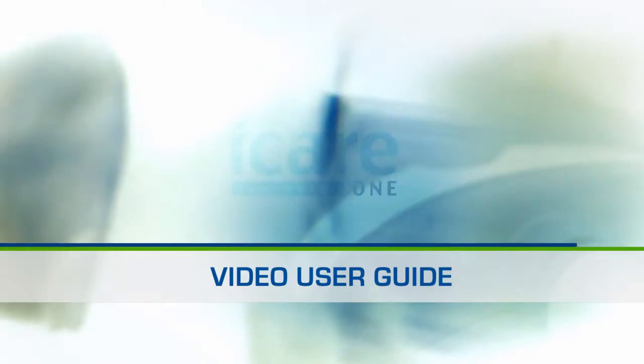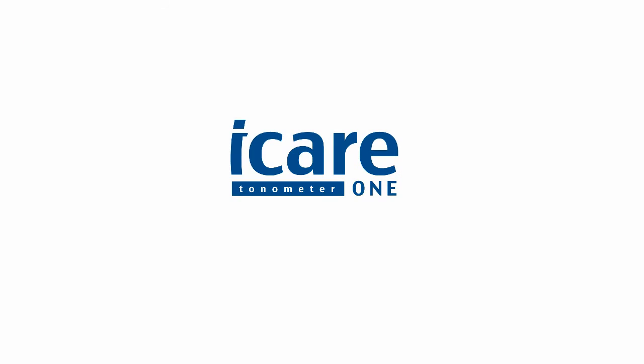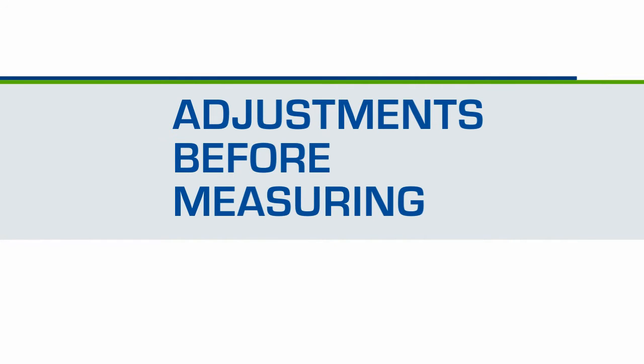Welcome to the video user guide of the iCare One Tonometer. Before taking the measurements, set the tonometer correctly.